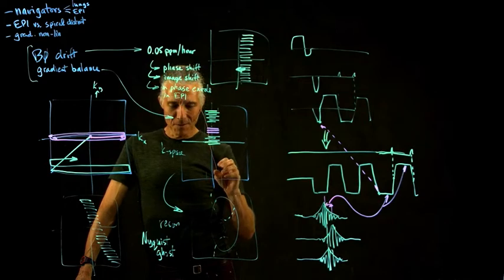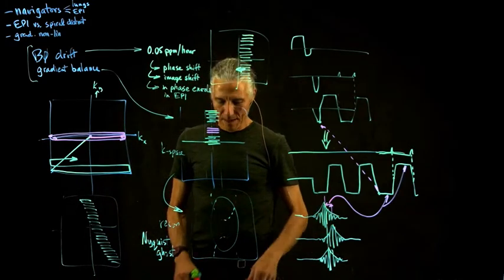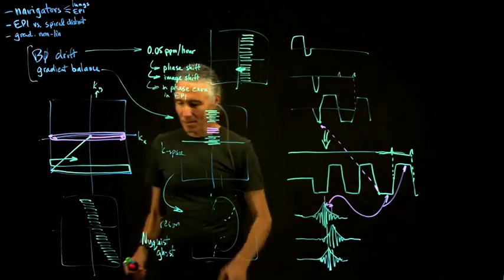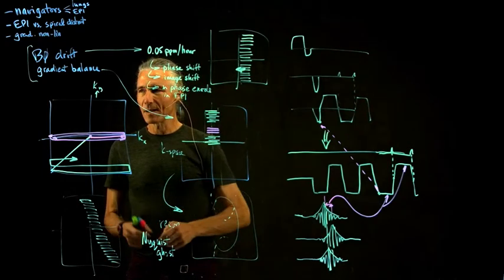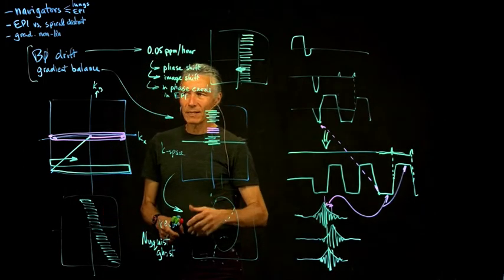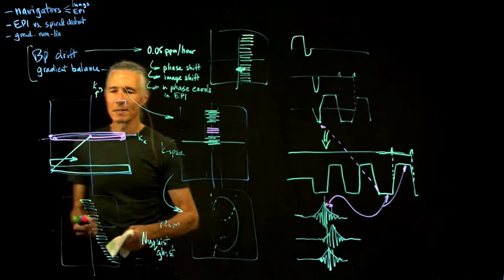You can't say, oh man, I set my tweakers bad and it completely messed up my data, because if you do this calculation here incorrectly, you could possibly make the situation worse. But too late, you've already collected the data in that state. And so one of the things about these hidden engineering things is they have to be very reliable, because you're directly affecting all the data that comes in afterwards. So that's one kind of navigator.